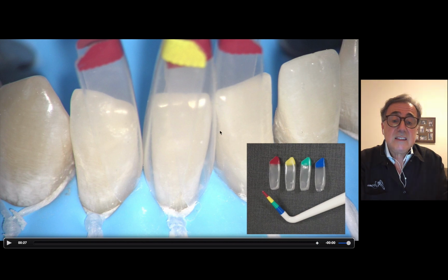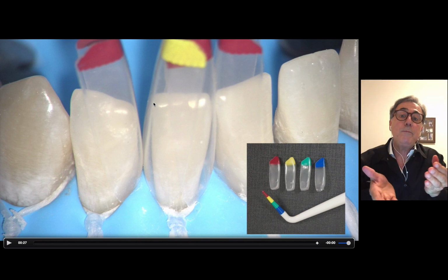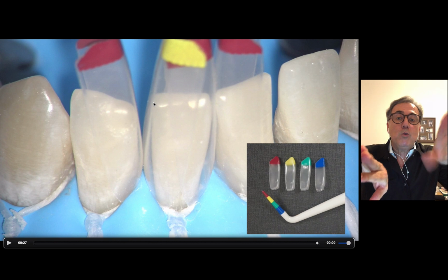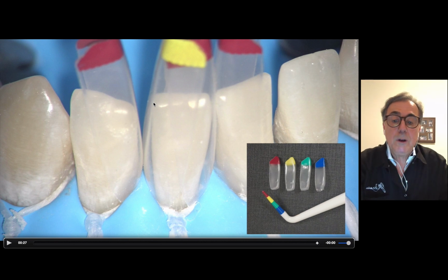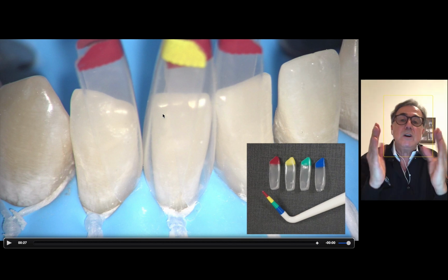Very simple. In this case, you can see we're going to do just one central incisor, just this tooth first, one tooth at a time. So I'm going to use one matrix at mesial, one matrix at distal, and then we're going to put matrices in the other neighboring teeth, one tooth on each side, just to ensure that we have the proper distribution of space right here. Okay, but we're going to do this tooth first. We're going to place those two matrices as if we're going to build an aquarium around the tooth.